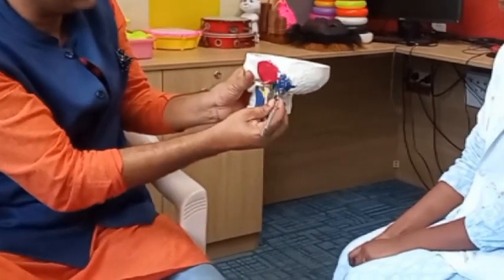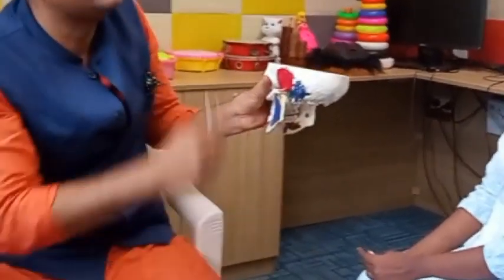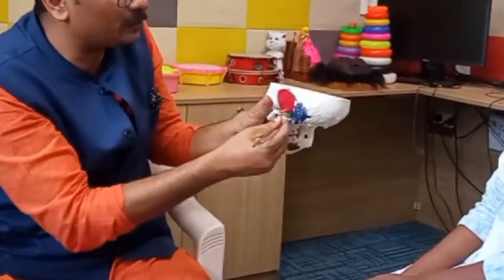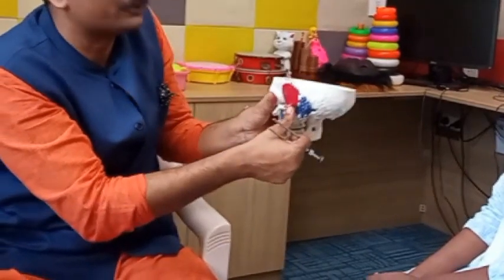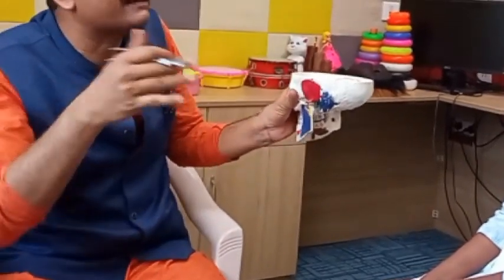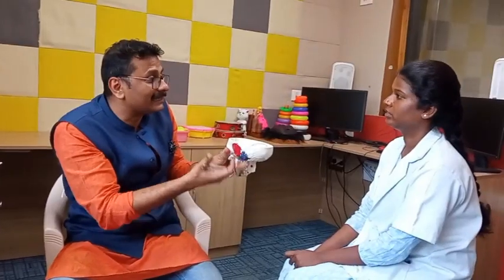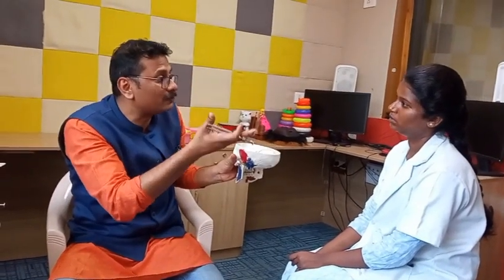So, now I am placing the tuning fork here — she was hearing it, then she puts down her finger saying that now I cannot hear it. So what do I do? I close this. As I close this, what happens? The sound which was coming out returns back and goes back to the tympanic membrane. What happens? There is an increase in the sound pressure level at the tympanic membrane. So the audibility which had gone emerges back. It is because of the fact that I occluded. That is known as the occlusion effect.